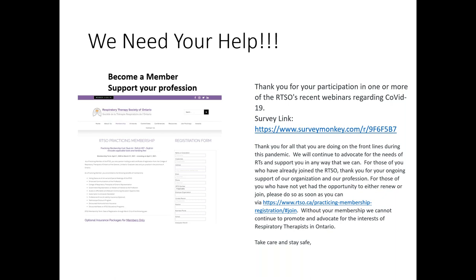So I would say that this is a real opportunity for the respiratory therapy department to work collaboratively with their anesthesia department to come up with a model where the frontline clinicians using the machines have appropriate resources, and have somebody they can call 24 hours if there's a question or a concern. The other thing I would really emphasize is to make sure that you have a bag valve mask resuscitator on hand in case the machine does fail.